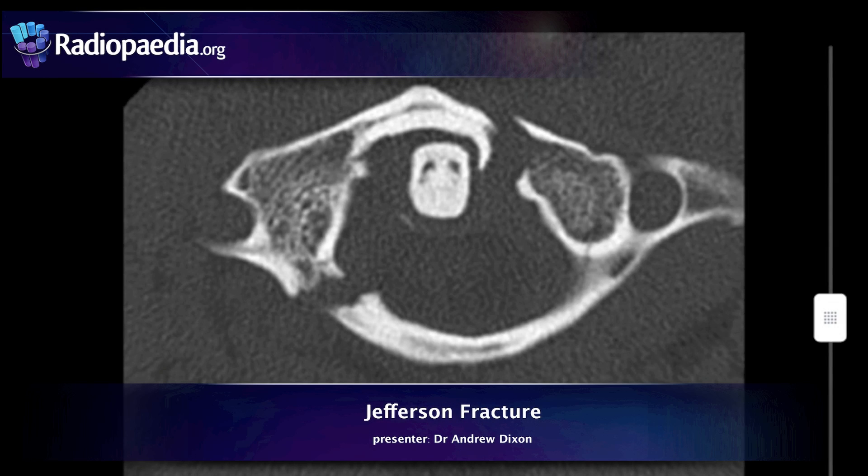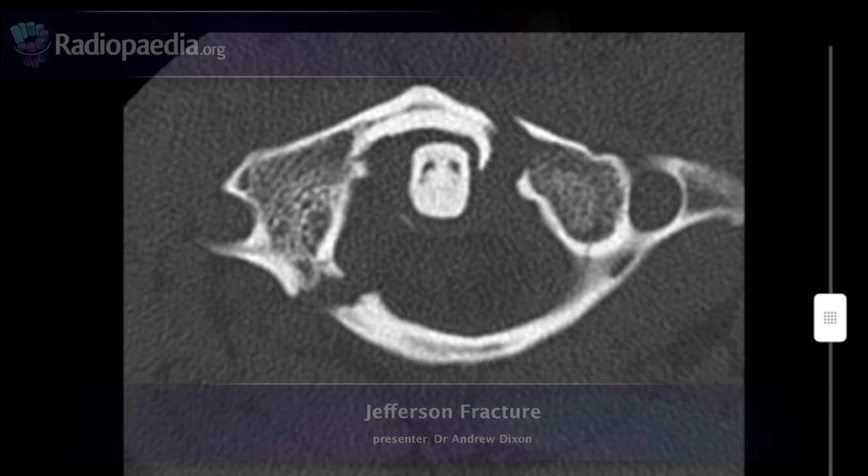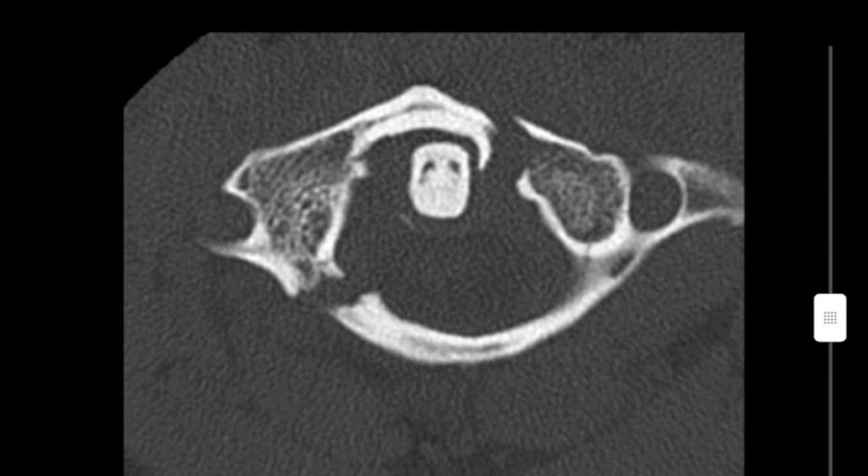Hi there, I'm Dr. Andrew Dixon from Radiopaedia.org, and in this video we're going to take a look at the Jefferson fracture, which is a burst-type fracture of C1 due to excessive axial loading, where fractures occur through both the anterior and posterior arches.